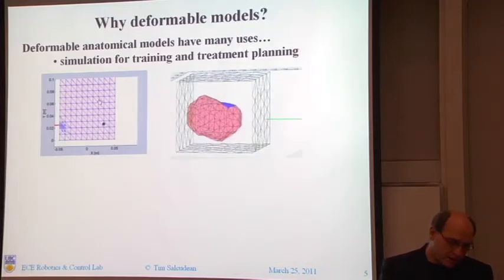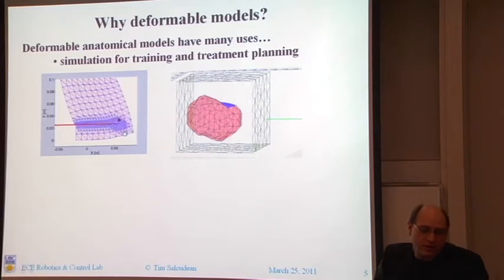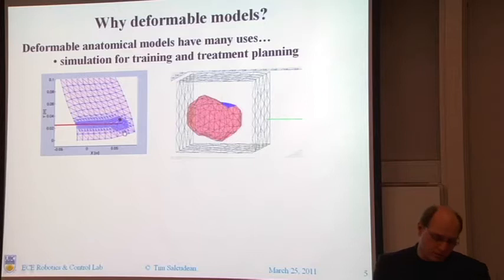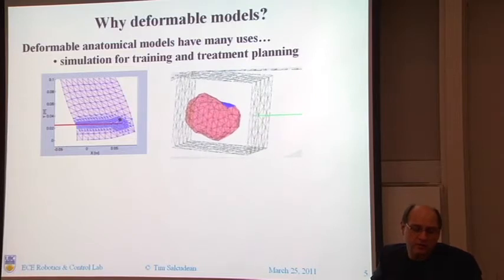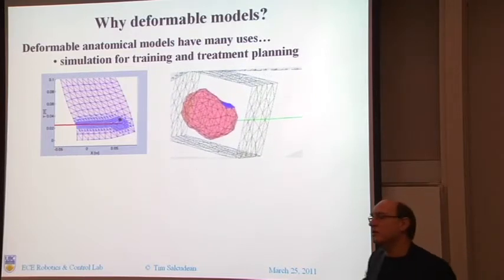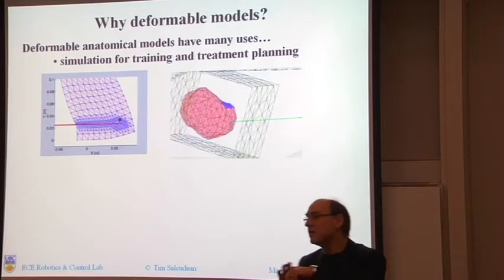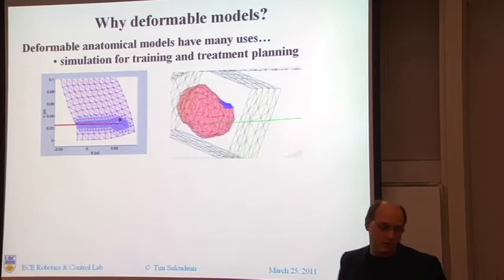And what happens is that you have a change in the target, which, even with an absolutely perfect needle, will still deflect. And if you do a finite element simulation, you will see that you have both a translation and rotation. The translation comes from the fact that the prostate is slightly better anchored at the pubic arch level than it is posterior to it.